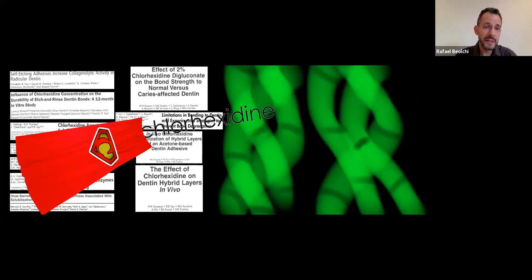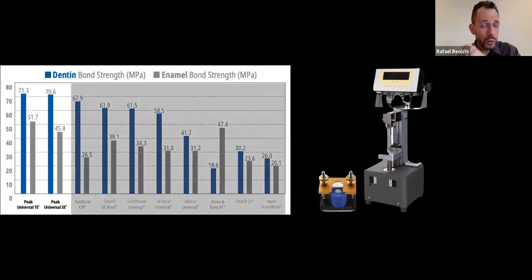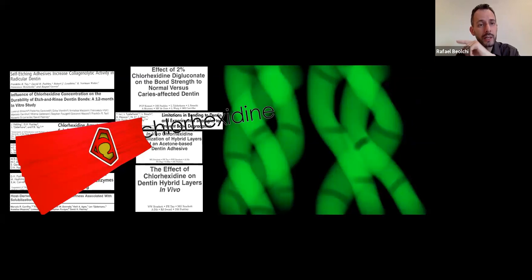One of the things I like is it is not strong because of chlorhexidine. This is important. It is strong because there's a lot of filler. There's a lot of phosphate monomers in it. So it is very strong, but it also has chlorhexidine. So when we're talking about dentin, and this is not the case because I'm bonding in this particular case in enamel, when there's dentin involved, chlorhexidine helps with longevity of that. It's not that it is stronger because of chlorhexidine, it's only that it lasts longer because of that. Not this case. 2 weeks from now, we're gonna talk about that.